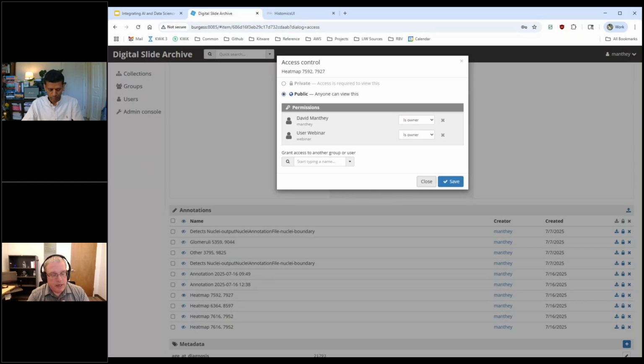There are some things where we have social debates about, if I copy annotations that I'm allowed to view but you created, into a directory that you also have permissions to, who owns the annotations after they've been copied? There's no technically right or wrong answer to that, so much as a social answer that you need for your project. So there's some complexity to that system.